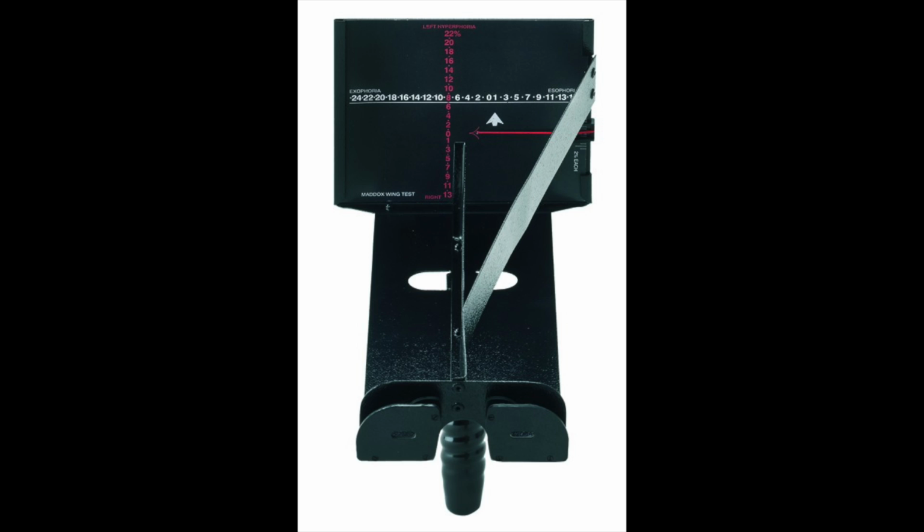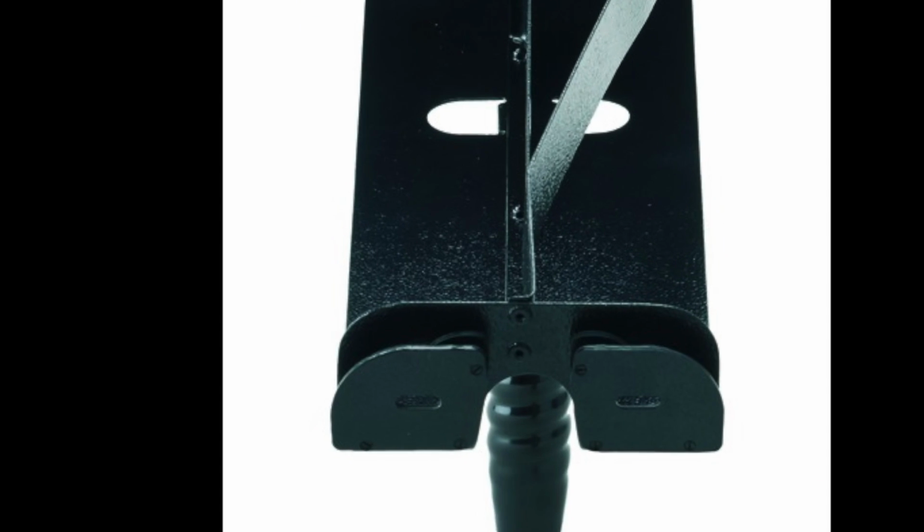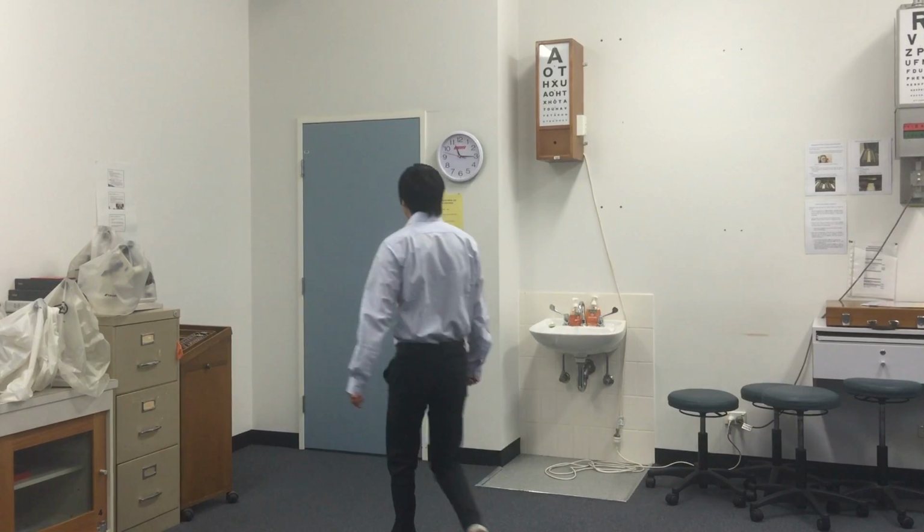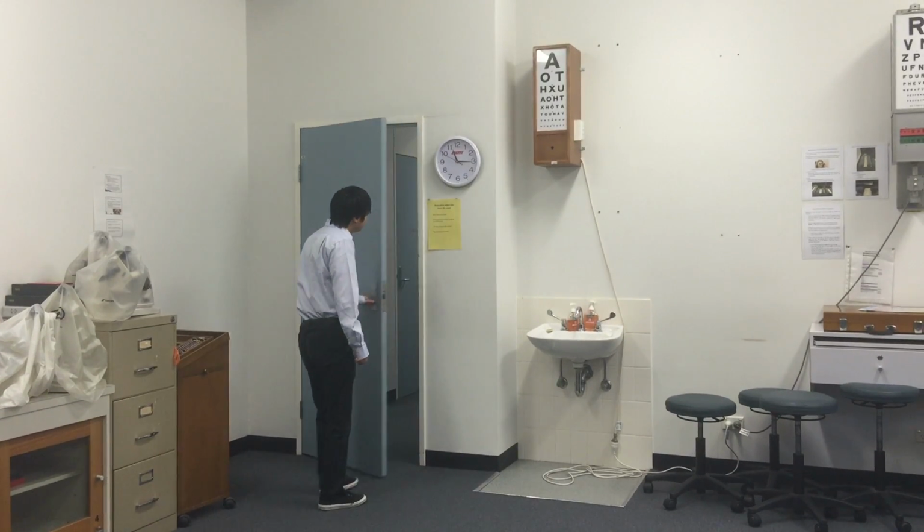The mechanism. The Maddox Wing dissociates the eyes by the two septa. The septa are arranged so that the horizontal and vertical measurement scales are seen in the left eye and the red and white arrows are seen in the right eye. Now we're going to look at how to perform the Maddox Wing test.